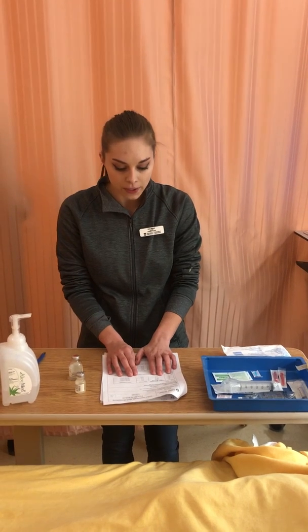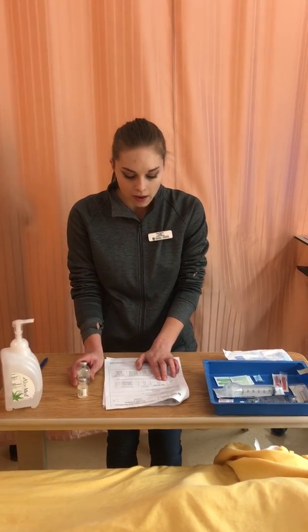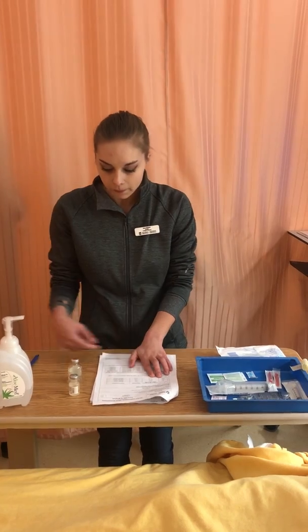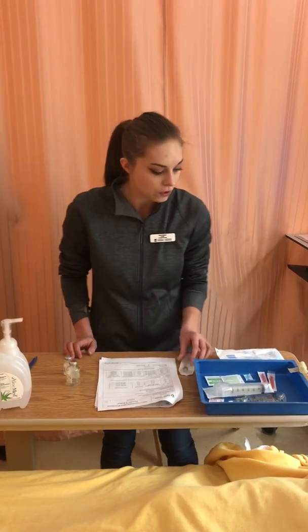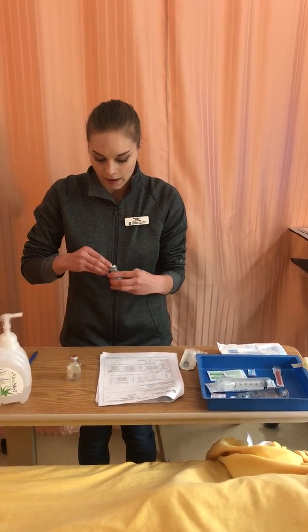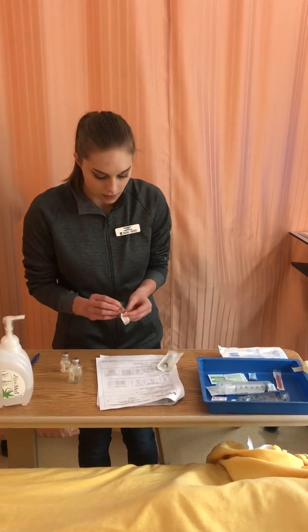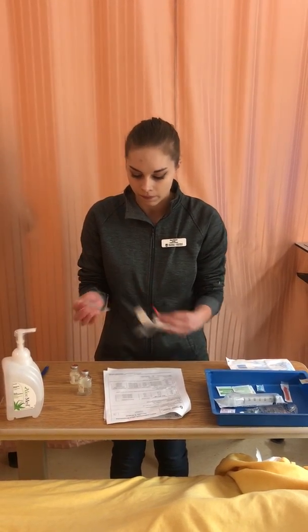So according to the reconstitution instructions, for my 5 million unit vial, I'm going to reconstitute with 3.1 mLs of sterile water, which I have. So I'm going to use a 5 mL syringe and a blunt fill needle. I'm also going to remove the metal bit off of here. So now that my vials are dry, I can withdraw my medication, or my sterile water, sorry.